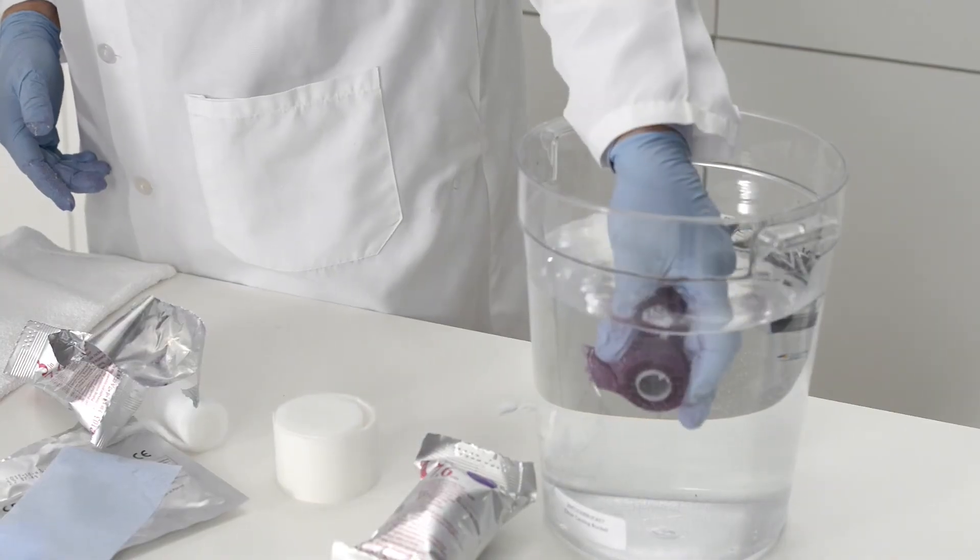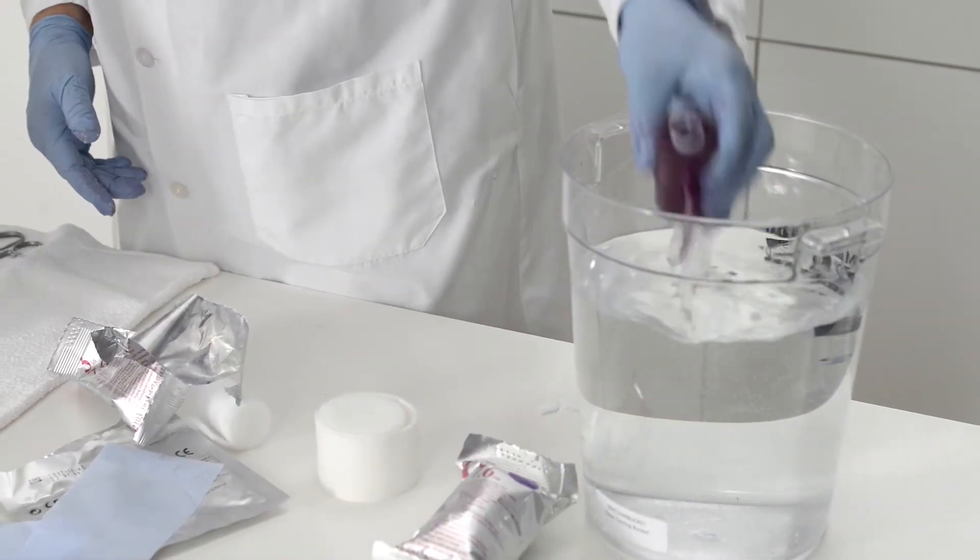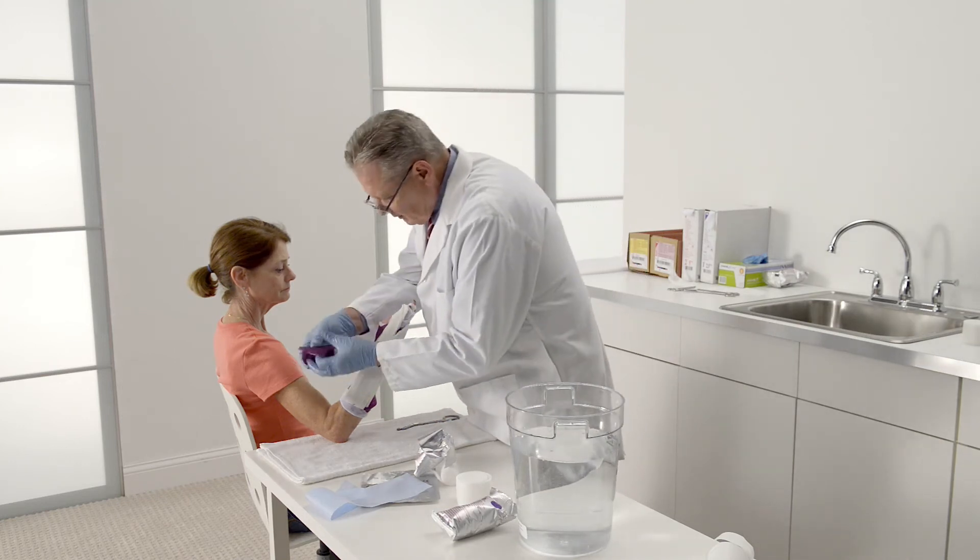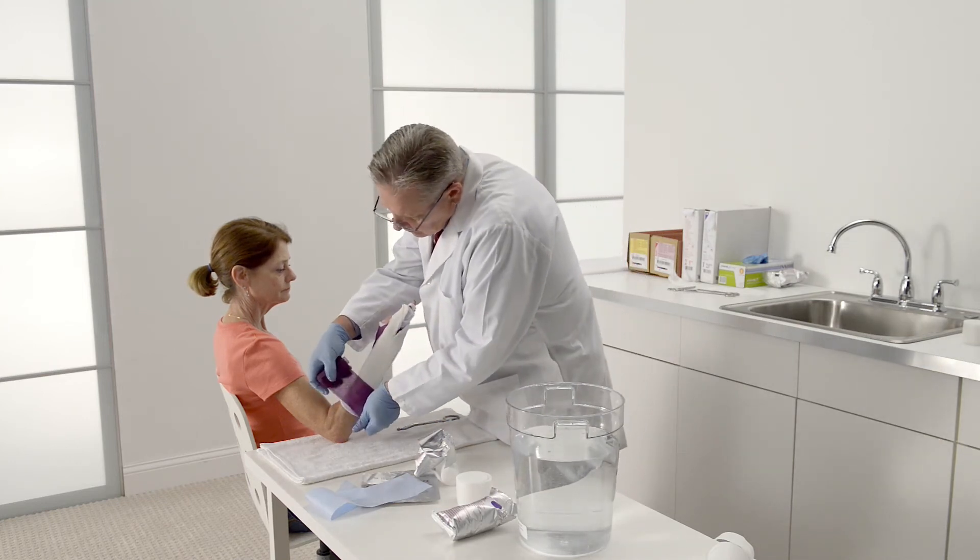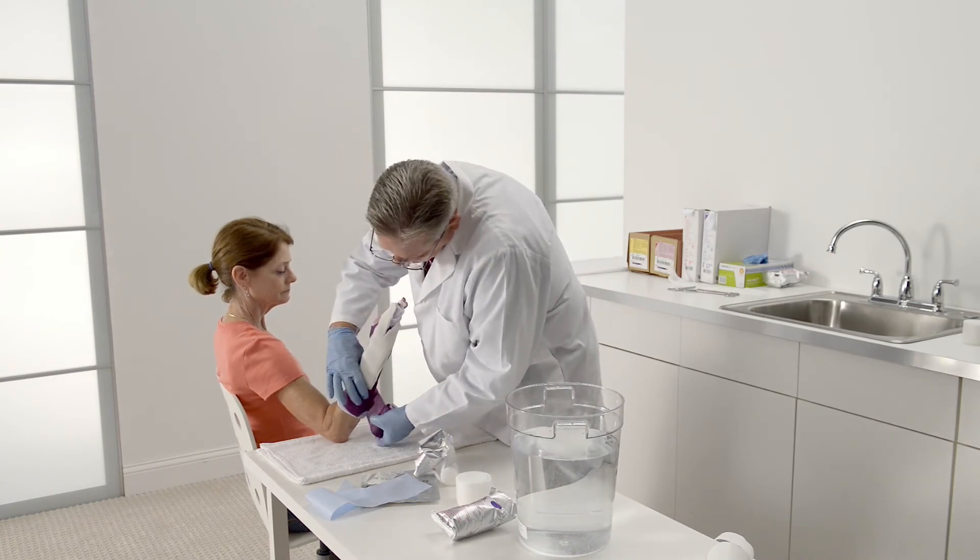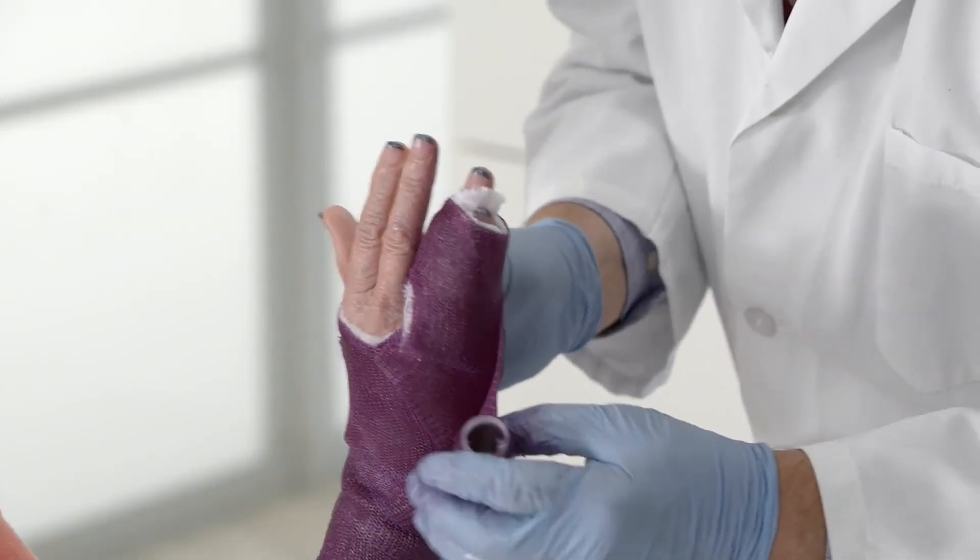Overwrap the splint with the second layer of casting tape. Dip the roll in water. Do not squeeze if the maximum set time of five minutes is desired. For faster set time of three minutes, squeeze the roll three times. Roll casting tape from the bottom of the arm up to the wrist and fingers.